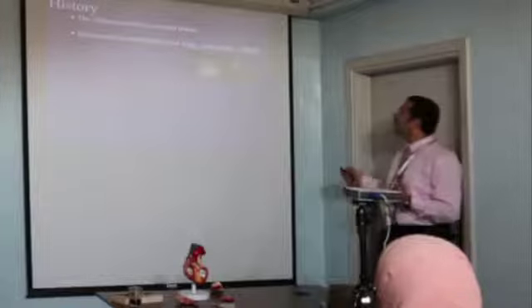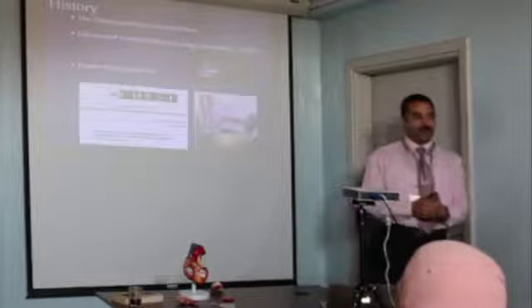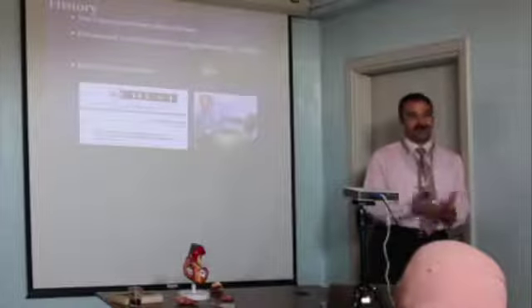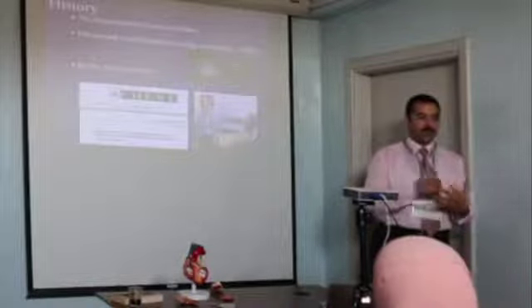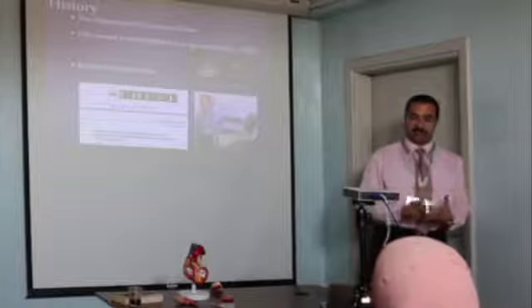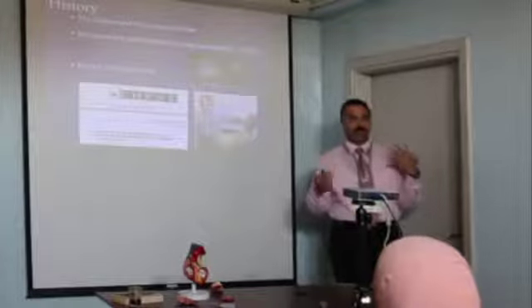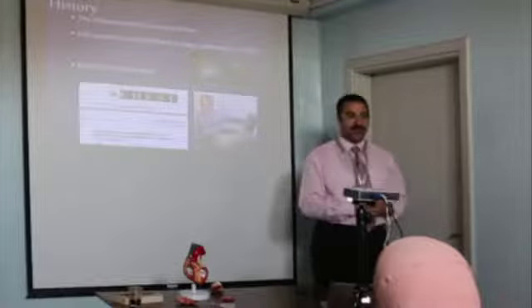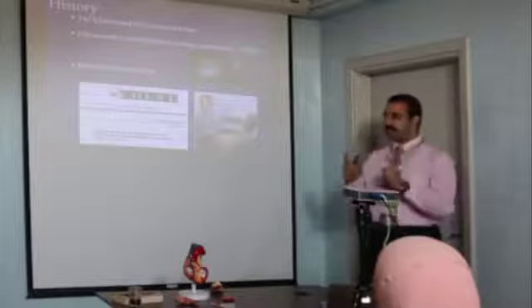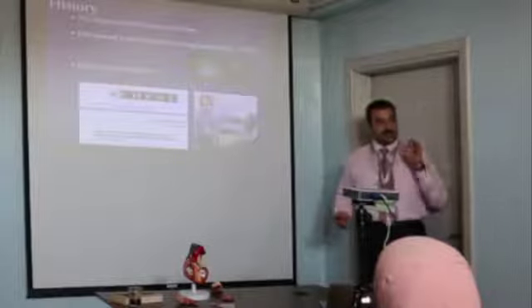So this is the Chinese alphabet, and this young man, Daniel Lichtenstein, the hero of ultrasound lung, changed the view. He said we can use ultrasound in lung assessment. He's an intensivist and head of department in Paris, France. He published 500 plus cases of complex ICU scenarios and was able to diagnose more than 90% of the cases using just ultrasound lung, with more than 90% sensitivity and specificity.